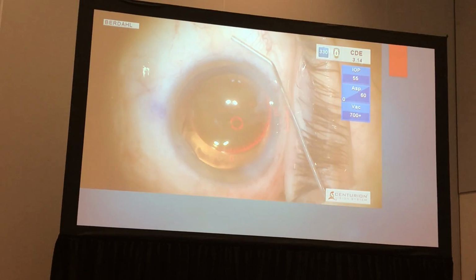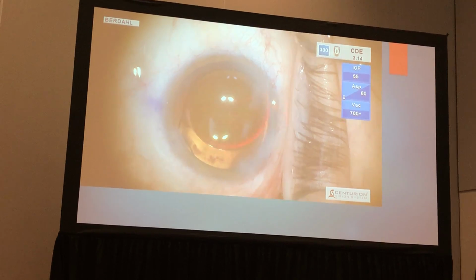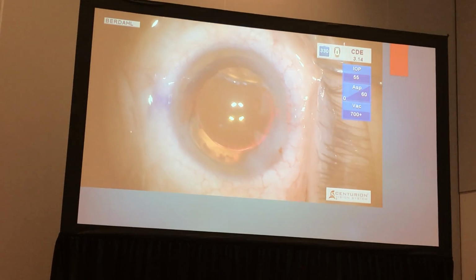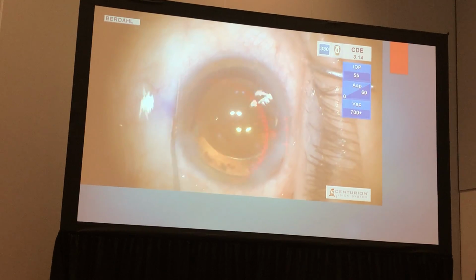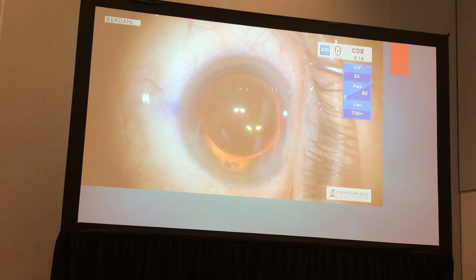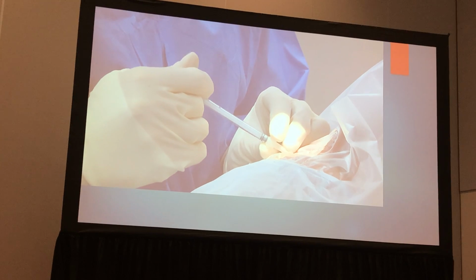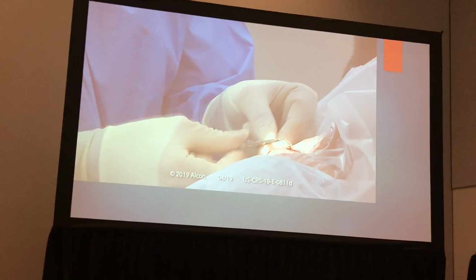Some good videos out there show that most rotation occurs in the first 24 hours, and usually because the IOP is low. Look over to your right just a little. Now look right at the light. Perfect. So I love that alignment. I feel great about it. Get some of that mucus off and then put in an injection and we're done. And so, you know, I feel like she got about as state-of-the-art a surgery as we can do with a toric multifocal and intraoperative aberrometry and good ocular surface management.